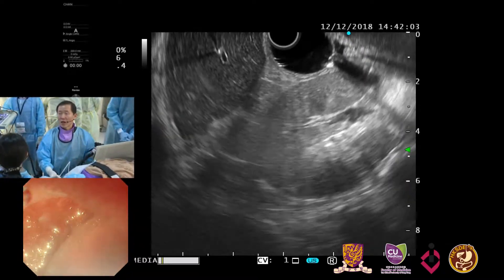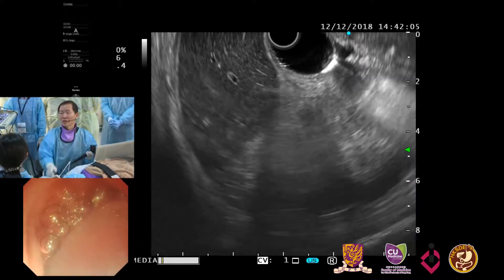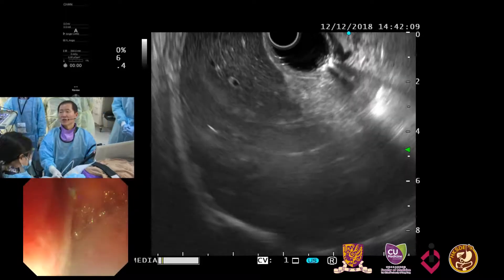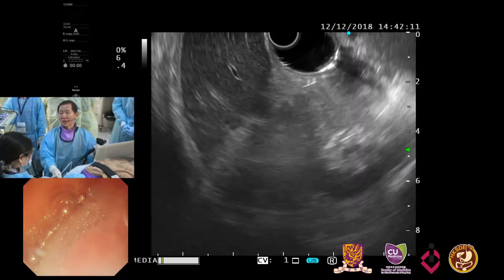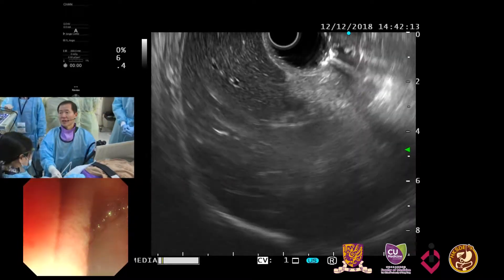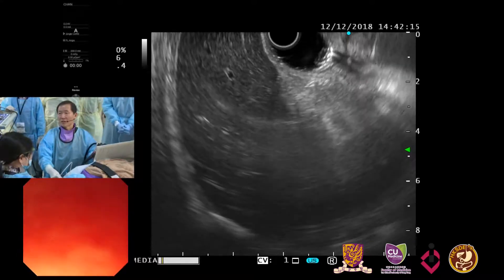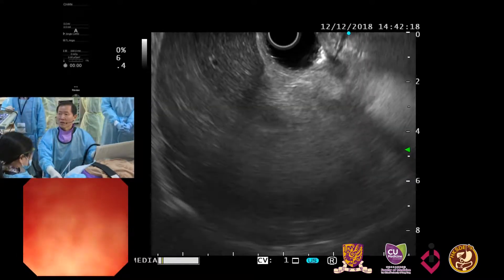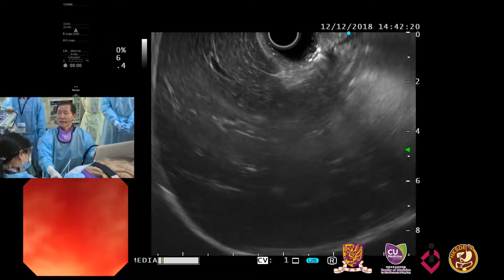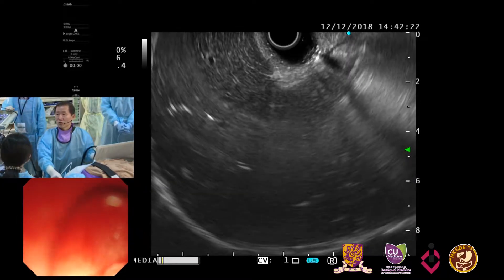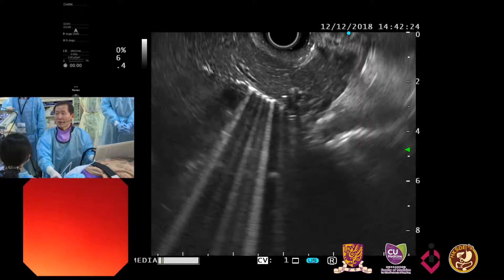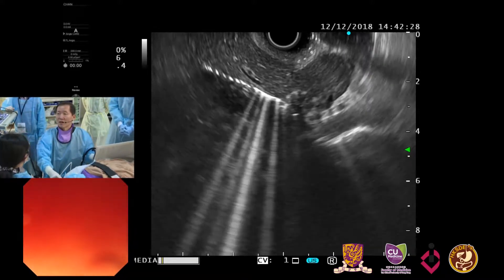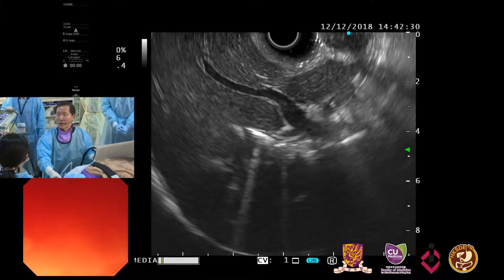We are having an upside-down view here. So the lower part of the screen, as I mentioned earlier, is segment seven, and the upper part of the screen is segment six. If I rotate my scope clockwise little by little, then we can go to the anterior segment of the liver. We can see a lot of pneumobilia inside the right side of the intrahepatic duct.